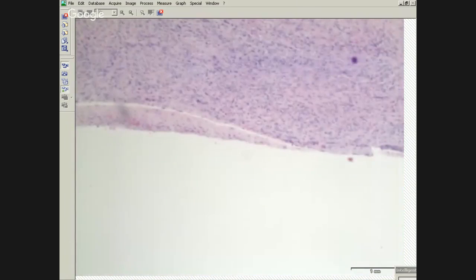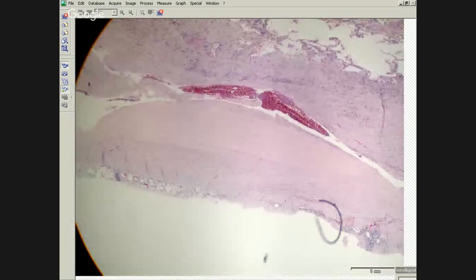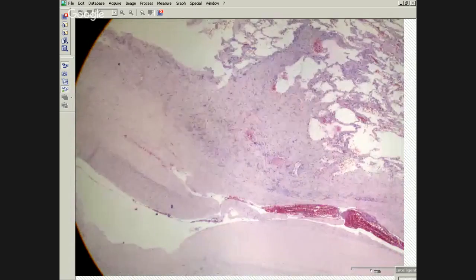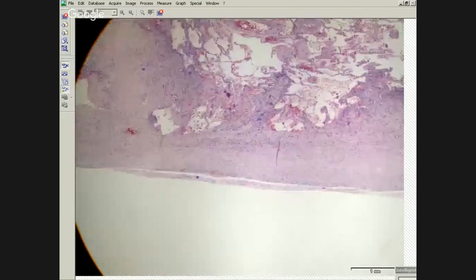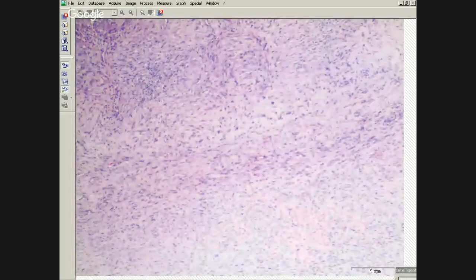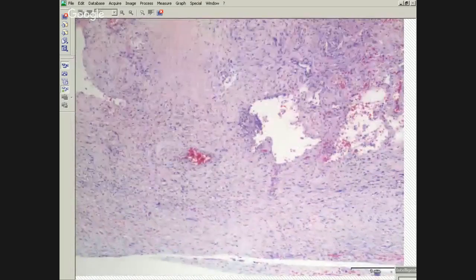Okay, so we're going to shift gears a little bit now. So again, a 65-year-old guy, diffuse pleural thickening. And again, fibrosis, but this time it is more cellular. And it's not all parallel. Right. Okay, very good. Not all parallel.